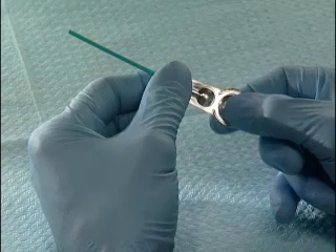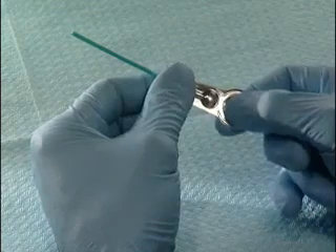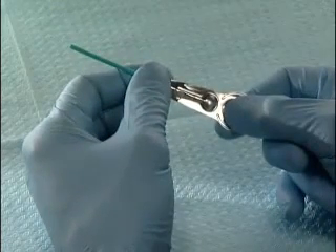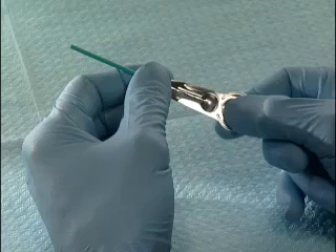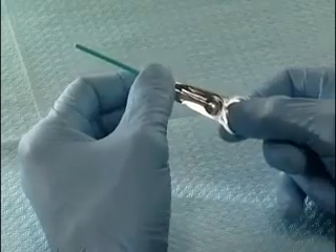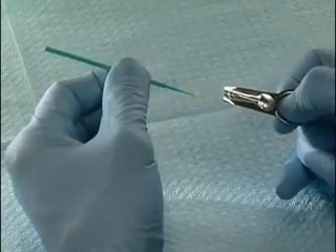With the thumb and index finger of the other hand, squeeze the reservoir of the unit dose blister, starting with the outer end, in the direction of the disposable applicator. Turn the disposable applicator back and forth in the liquid to wet it completely.